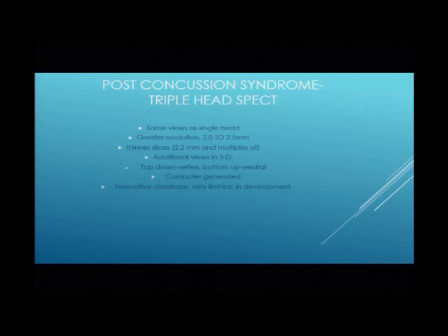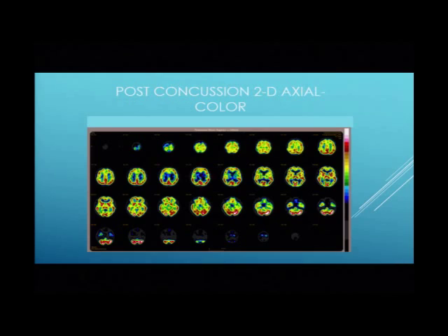And with digital analysis of these SPECT scans, we're able to actually create more views of the brain. We could do subtractions. We could do a lot of fancy things. Let me show you what that looks like. You see how crystal clear that is? We only had about 10 or 12 sections to get through the brain, and I had this cut in half because I like to stack them so you can get more information.